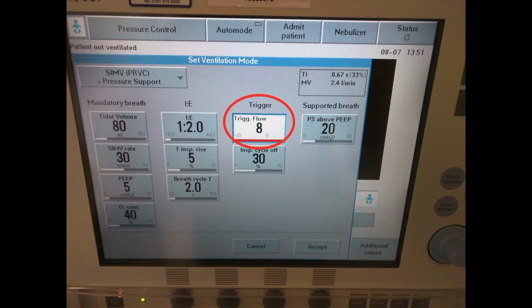There's some gas not coming back that it's sending out. So provided the amount of gas missing exceeds the threshold for the ventilator to trigger, the ventilator interprets this as the patient starting to take a breath, so it releases a breath to the patient, so that the breath is given at a time the patient is starting inspiration. And you'll see this with a little purple mark on the flow against time graph, which I'll show you in a minute.